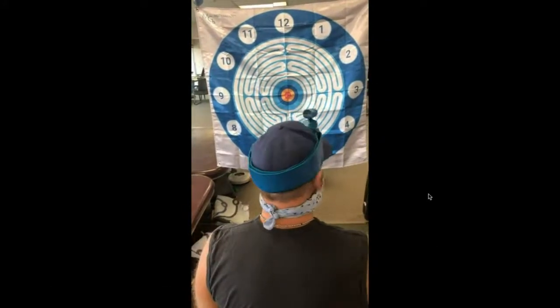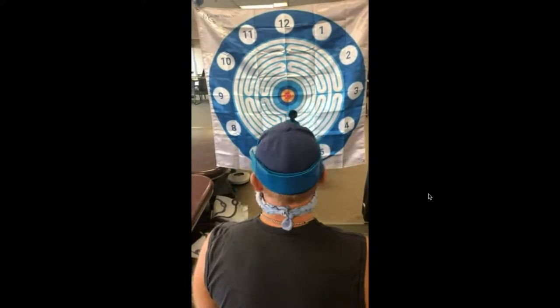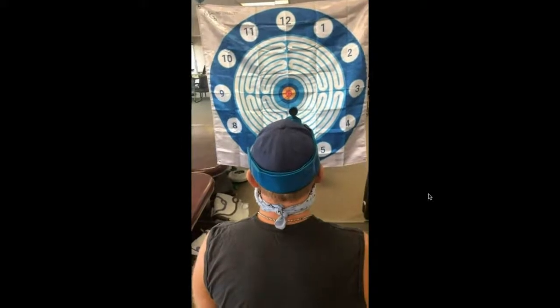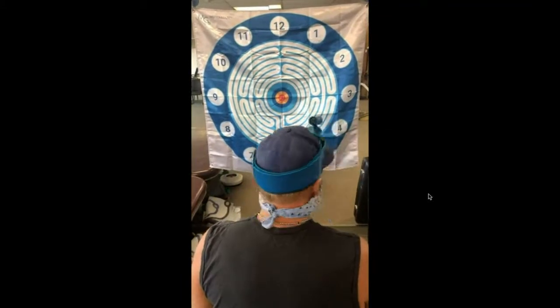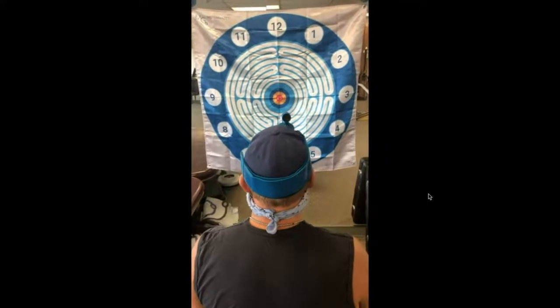Let's see if I can get this. And then he's going to come back to where he thinks the center of the target is, and let him kind of work on it for a second and then determine if they're in or out. So that was outside, barely. He's going to do another one here. He's going to come down. He's going to overshoot again. So that's outside the standard deviation again.